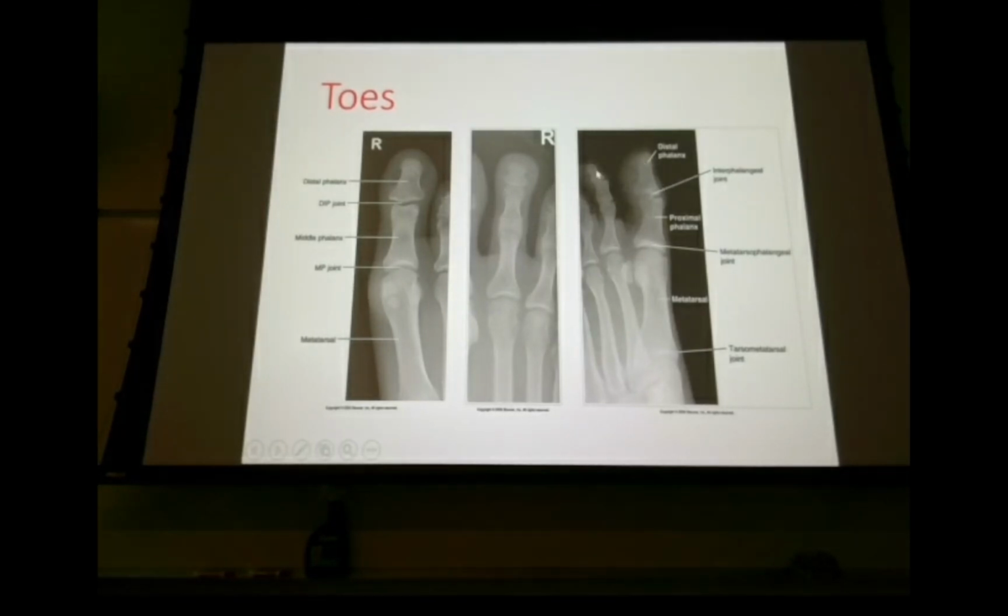It looks like we've actually got some quantum mottle on this one. That's kind of cool. Keep in mind we've got sesamoid bones under the first toe. I'm going to scroll back up here in a second and show you all the different places we can have sesamoid bones on the lower extremity, and there's a lot of them. And the sesamoid bone may be because of trauma. You may wind up with a slight avulsion off of maybe the back side of the ankle, maybe off the distal portion of the talus, and it just kind of stays there. Or it could be just a formed sesamoid bone.